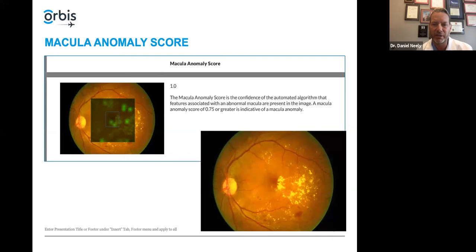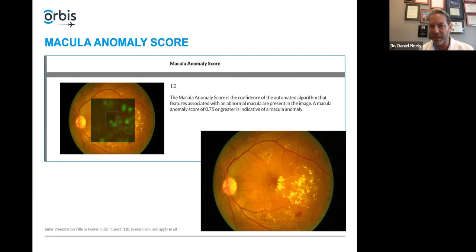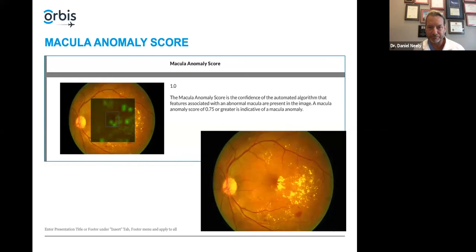Finally, there's the macular anomaly score. The Pegasus system highlights areas within the macula which are significantly abnormal and gives you a grade. If that score is higher than 0.75, it's highly indicative of a macular anomaly. This one was 1.0 — it was maxed out. This is clearly an anomalous-looking macula. This example was chosen because it has very prominent findings, but I also want to show some that are more subtle, because that's also going to be very useful.